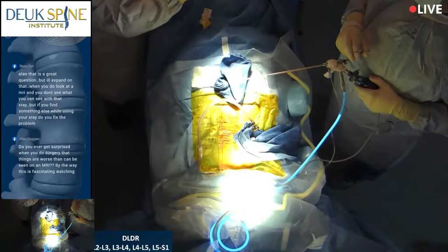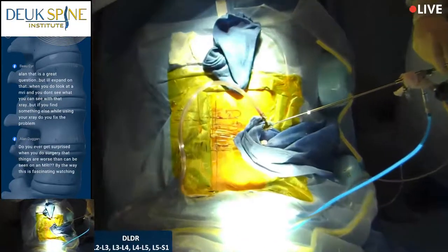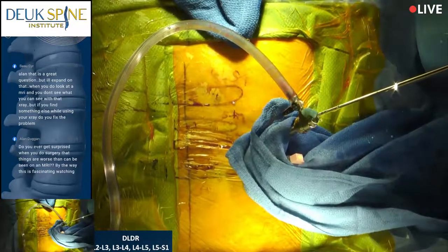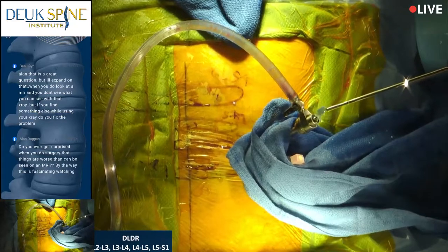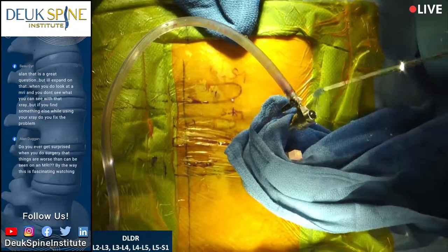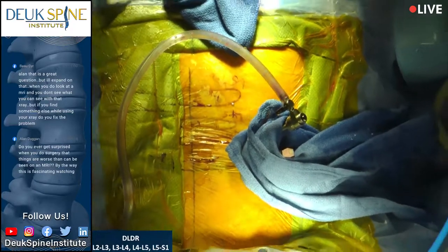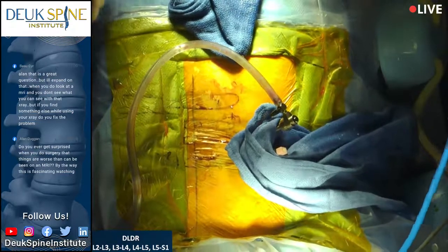But I had to bring you this massive, look at this. Can you see this? Flynn? Yes, we can see it. All right, that is a big herniation. By the way, it was literally twice that big, but I couldn't get it all out, so I pulled off pieces for the last 5 minutes. So there's a giant herniation right there we just got out. All right, can you see that? Pretty cool, huh?